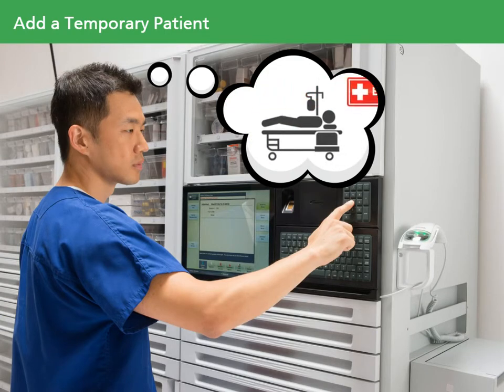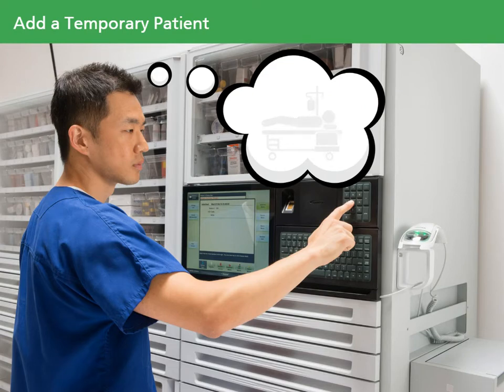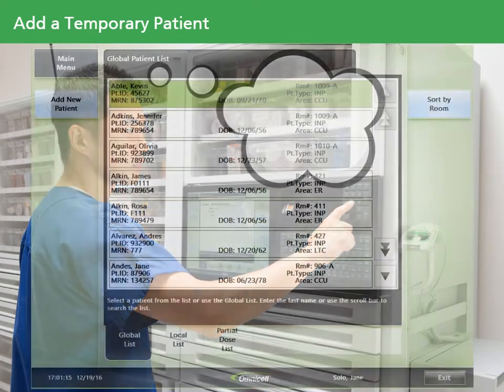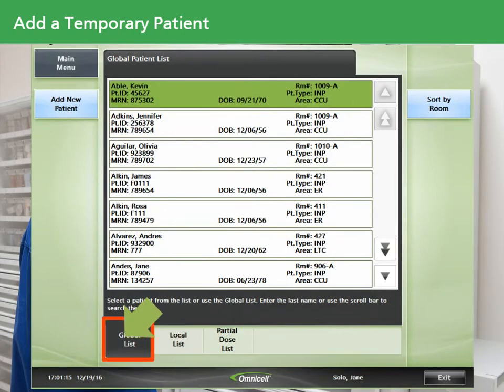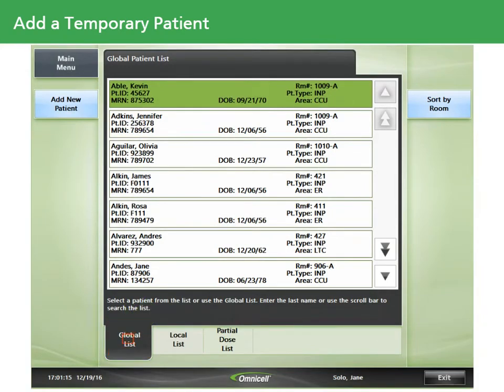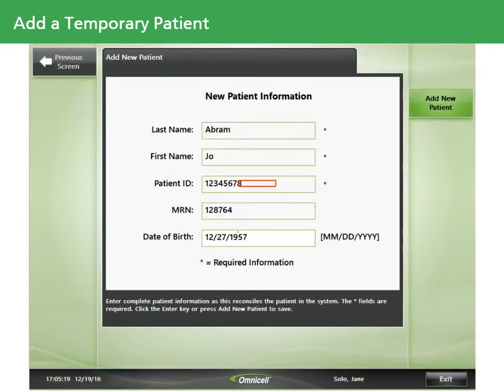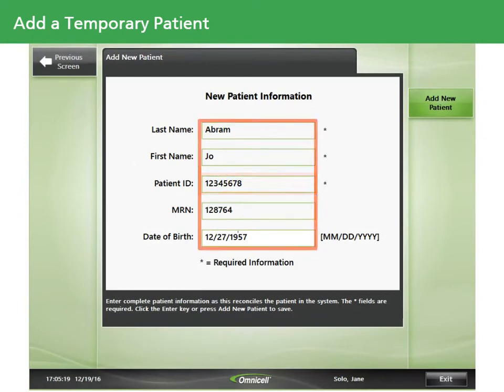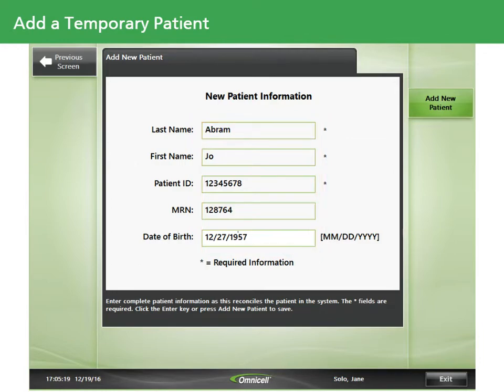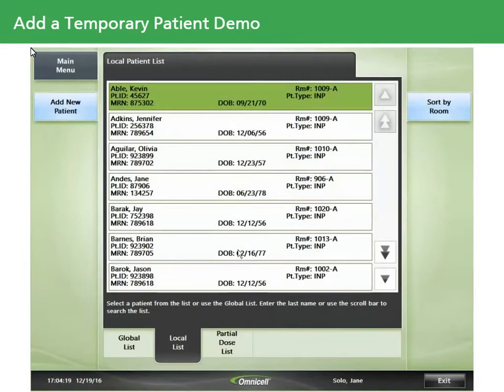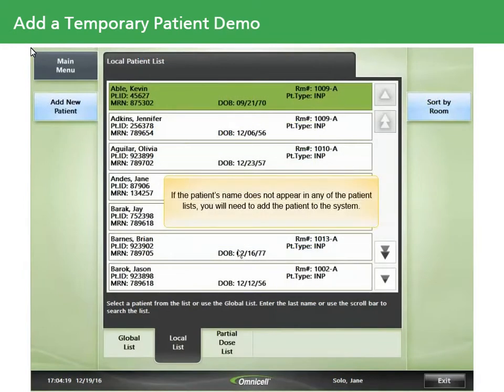Occasionally, you may need to add a new patient if your facility does not allow all users to see the global list of patients, or if the patient has not been registered by admitting — for example, an emergency department patient who hasn't been registered yet. Before adding a patient, always verify that the patient is not on the global list. Enter the patient's account number if you know it. If you don't, enter as much information as possible, such as date of birth or MRN number. If the patient's name does not appear in any patient list, touch the Add New Patient button.